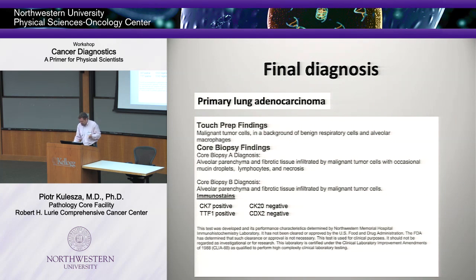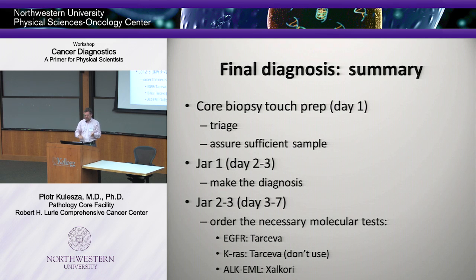And this is important. See, because this is my triage. So what we do is I know that if I'm going into this with a sort of differential diagnosis of primary lung carcinoma, I know that I'm going to have more specimens to do certain things.